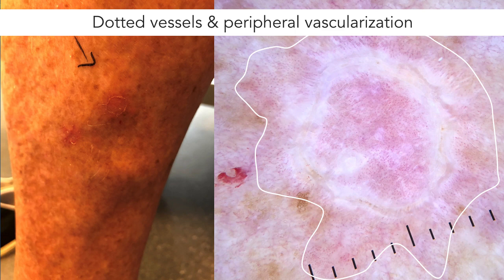Another vascular finding that can be found from time to time in porokeratosis is peripheral vascularization just outside the keratin rim. Demarcated by the white line, we see lots of dotted vessels around the keratin rim. We also see some dotted vessels within the keratin rim, but not as many in the central part of the lesion. In this case, we see abundant evenly distributed dotted vessels within the central atrophic area, but also surrounding the keratin rim within the white demarcation.